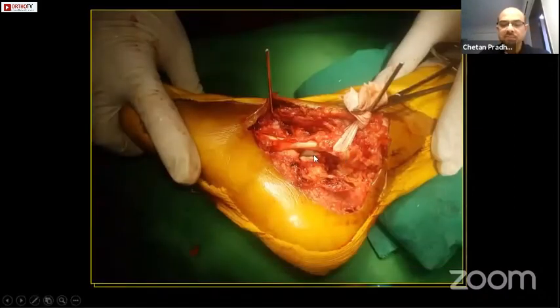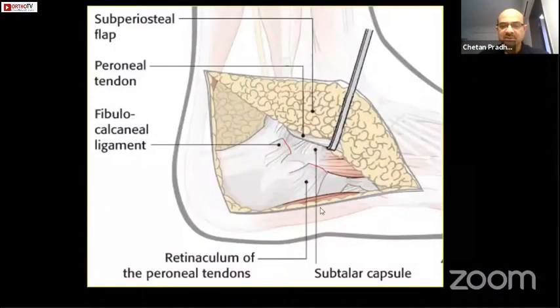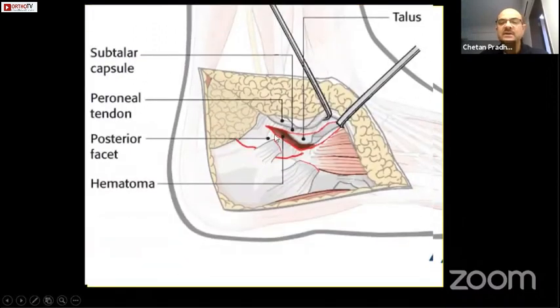Once you retract this flap and put the two K-wires, you need to visualize the posterior facet by cutting the calcaneofibular ligament. As you see, there is no calcaneofibular ligament visible here, and the peroneal retinacula also blend with the calcaneofibular ligament. This is how you raise it — this is the calcaneofibular ligament. You have to cut it; once you cut it, you will immediately see the posterior facet and the joint.